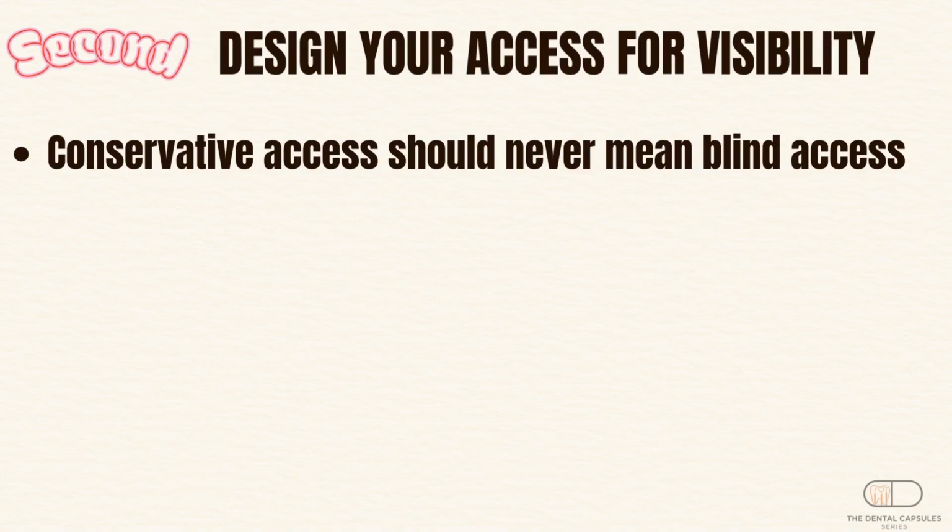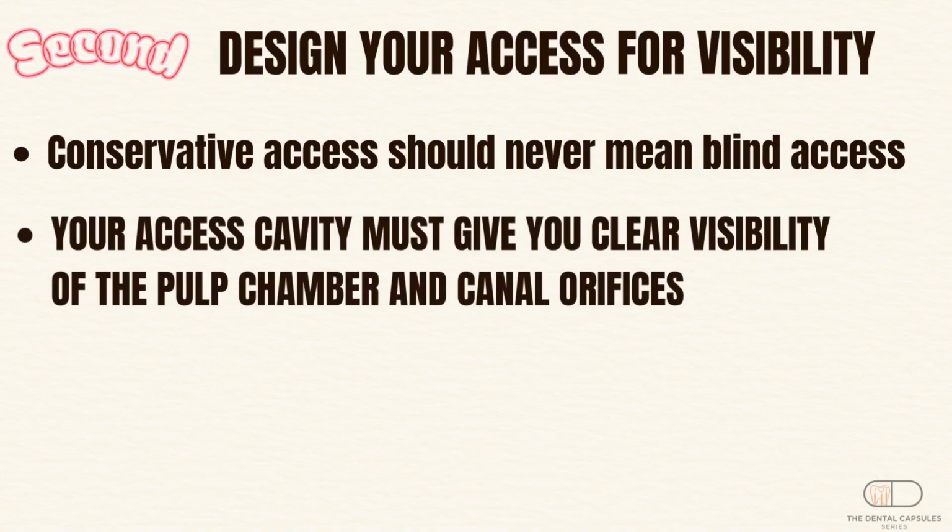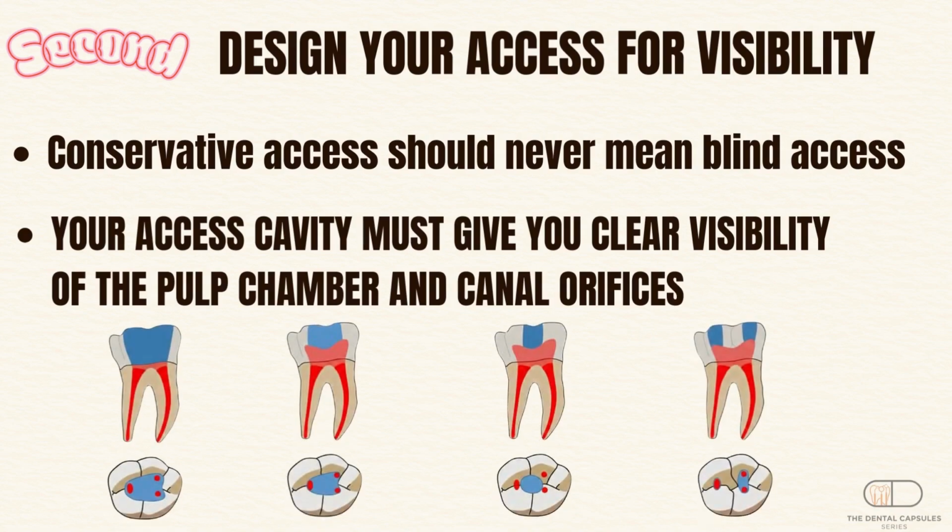Second, design your access for visibility, not just entry. Conservative access should never mean blind access. Your access cavity must give you clear visibility of the pulp chamber and canal orifices so you can clean, shape, and negotiate the canals properly.